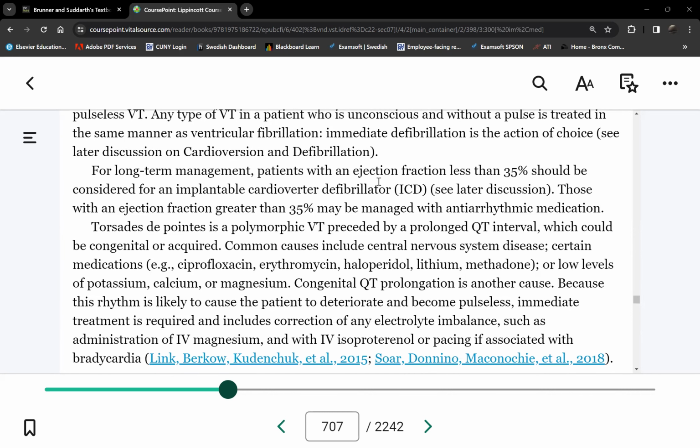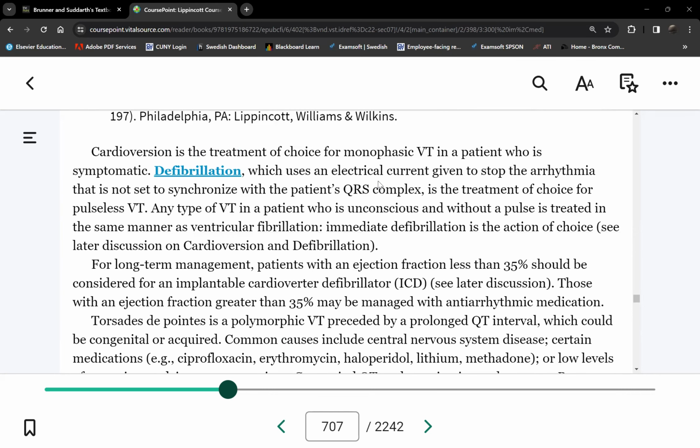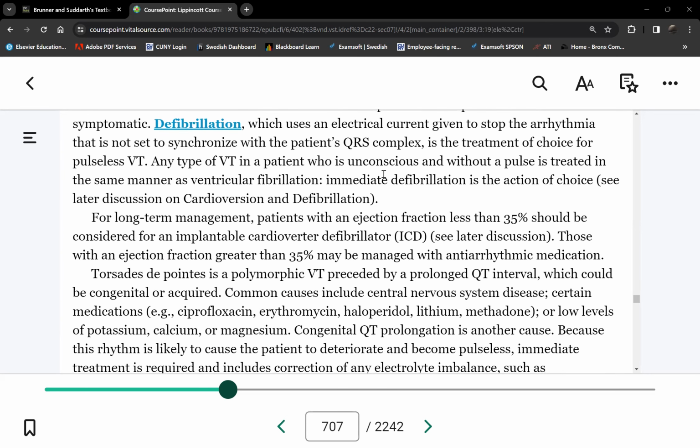Okay, once the patient survives cardiac arrest, which is what happened here, so the patient either had VTAC or VFib and they survived it, the recommendation after surviving a fatal dysrhythmia like this is an ICD. What is an ICD? Okay, it's a small device, a miniaturized defibrillator.